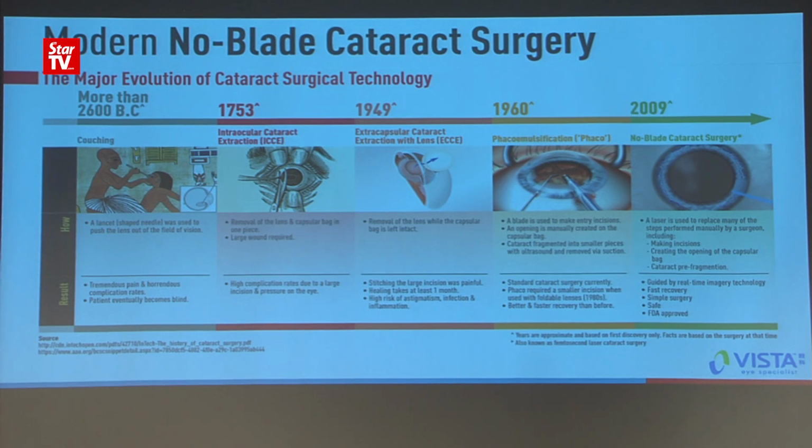That's why it's called phacoemulsification. At the same time, they suck out this emulsate. Because you need ultrasound energy to break up the contents of the cataract, heat is produced in the process. And this heat sometimes damages the adjacent tissue.